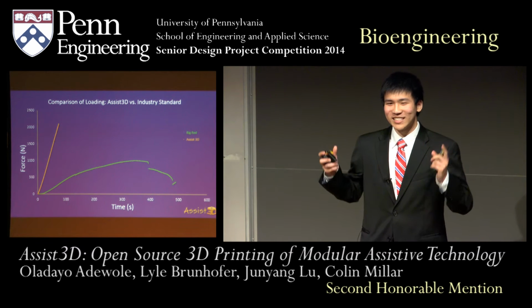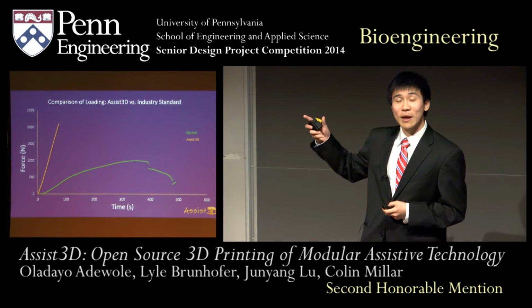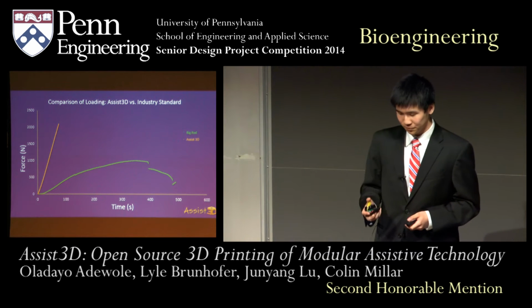Next, we have the safety. And we see that our button was able to outperform the industry standard, which is the big red button from AbleNet. And we were able to withstand almost twice as much force.